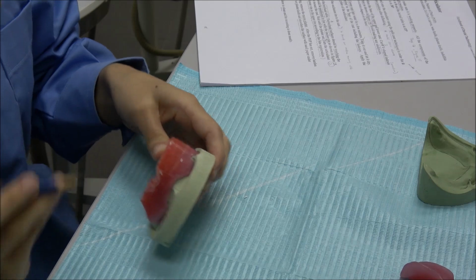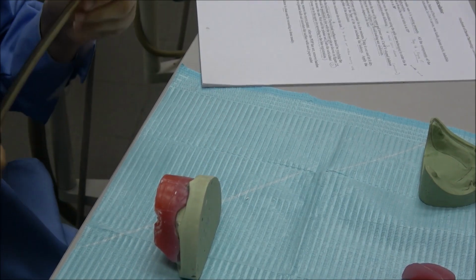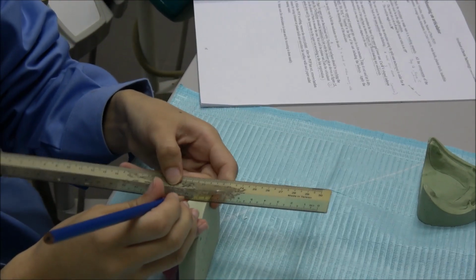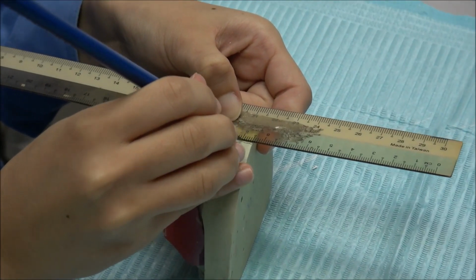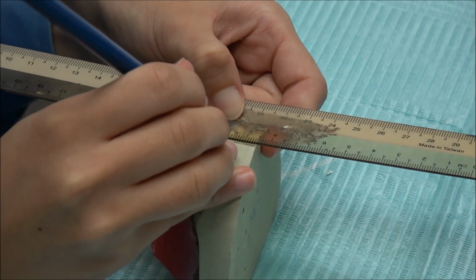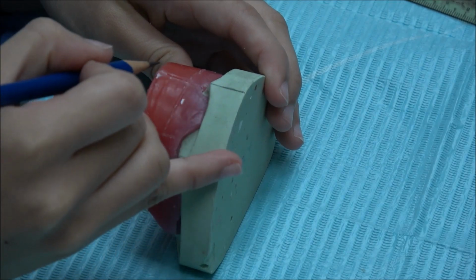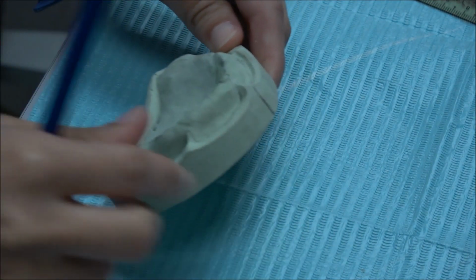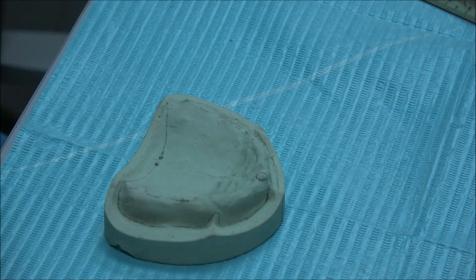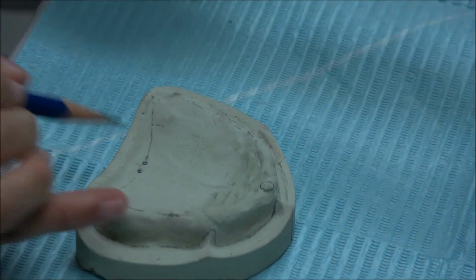Okay, for this part here, we have to draw a line. Can you see your midline is here? We have to follow our midline. We use our ruler to draw a line here, following our midline, to draw a line on our model. Draw a straight line. For the anterior here, we follow our midline, and then we take out our bite, and then we draw a straight line here. We follow the incisor papilla, and then to the palatal fovea.